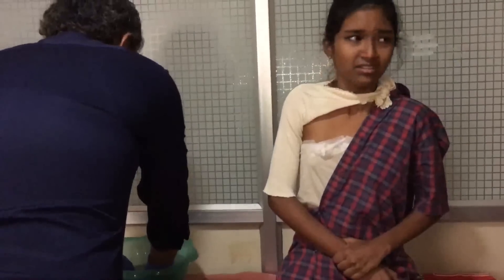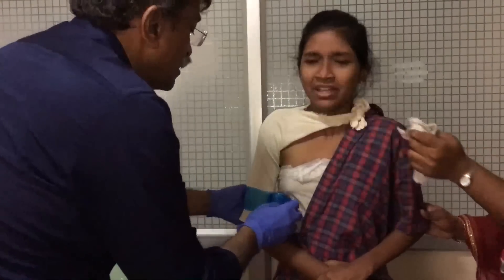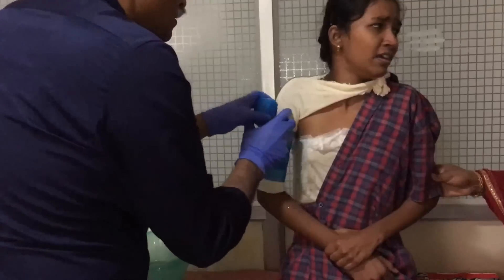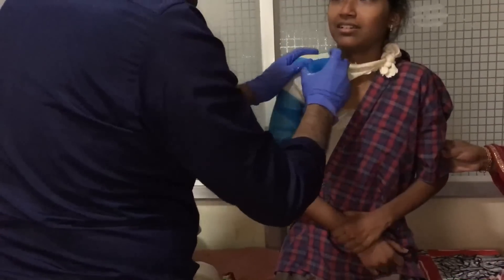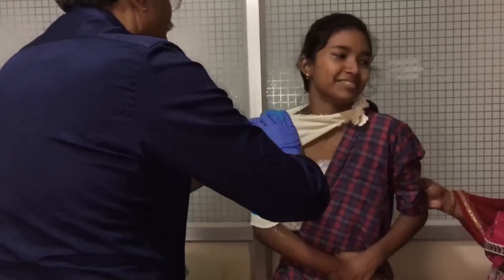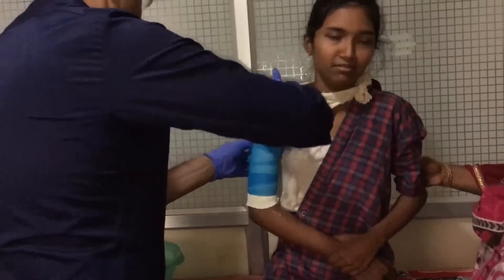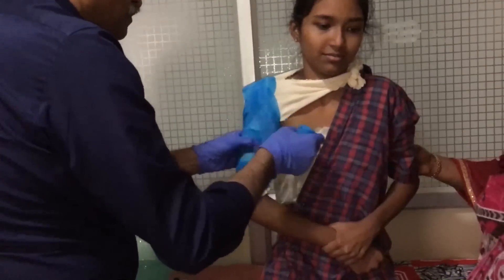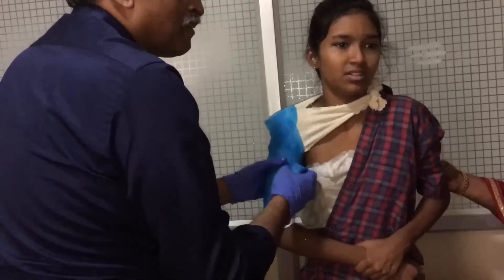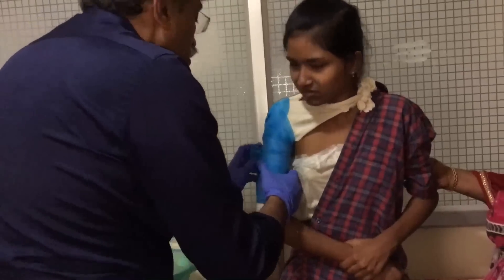One roll of 4-inch fiberglass cast is soaked in water, wrapped and moulded around the arm, ensuring that the sharp edges do not dig into the axilla or cause subsequent discomfort. Apart from a single layer of stockinette, no additional padding has been used.